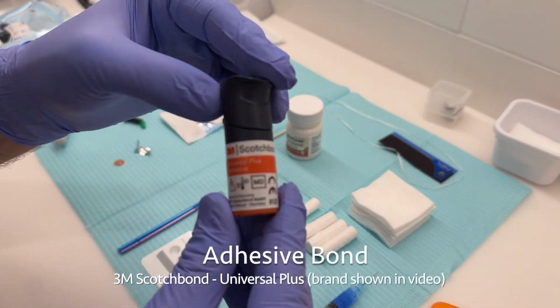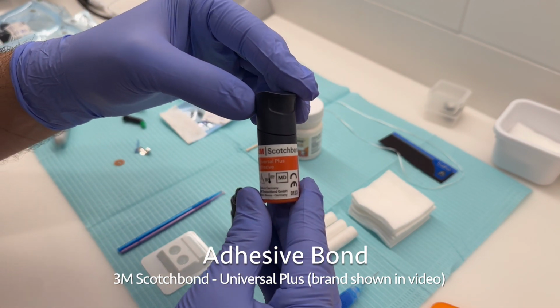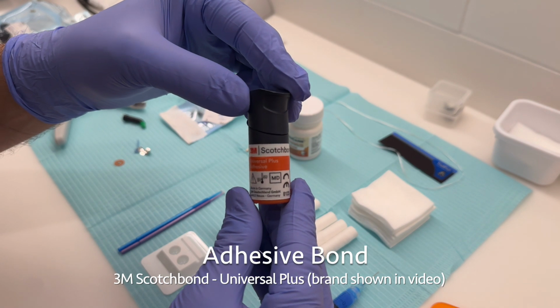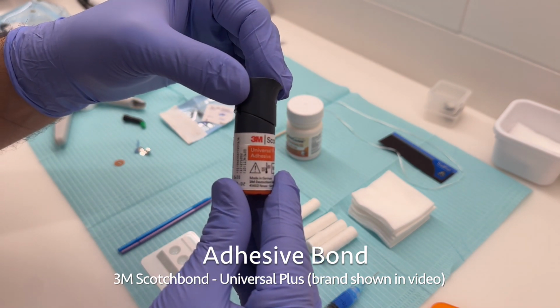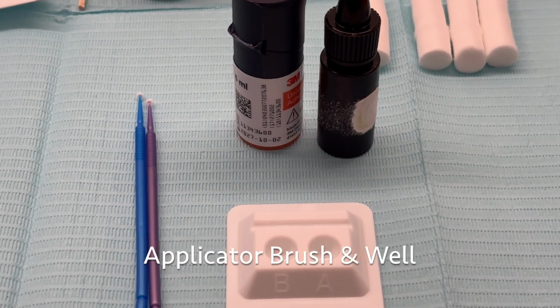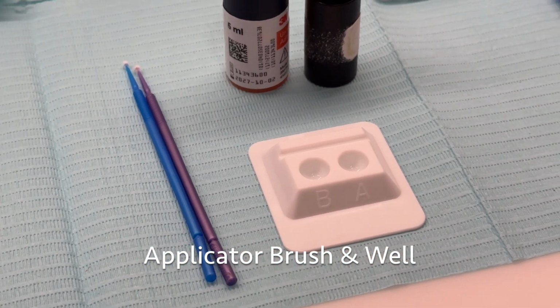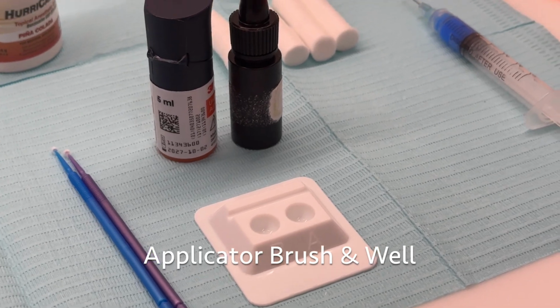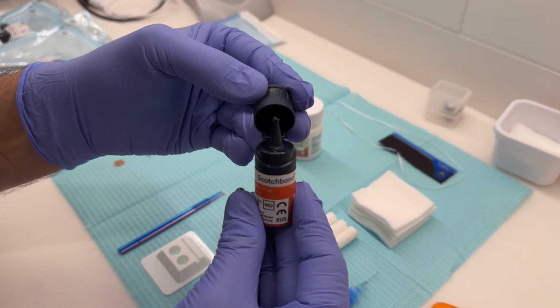Next, we have our bond. This is used on the cavity prep to help our composite resin material adhere to the tooth surface. This gives us not only mechanical retention, but chemical retention too. Always important to have in addition to your bond is your applicator brush and a well to put your bond into and have ready for application into the cavity prep.